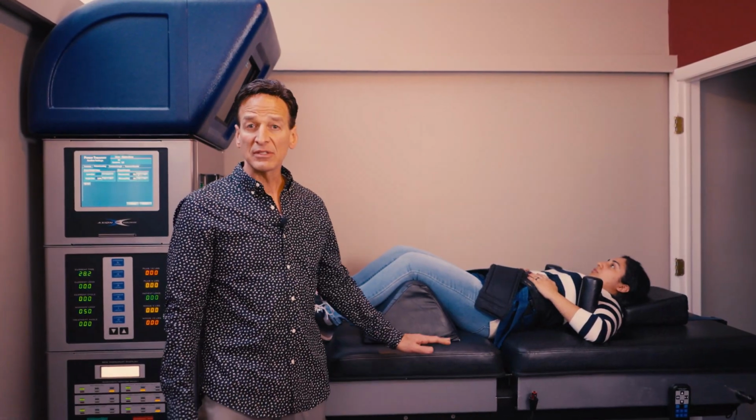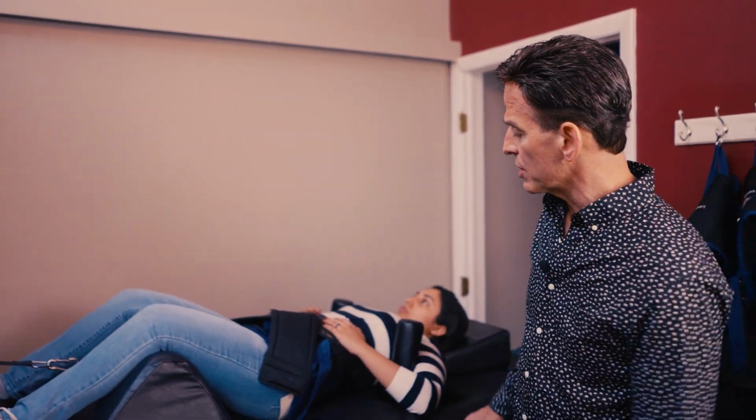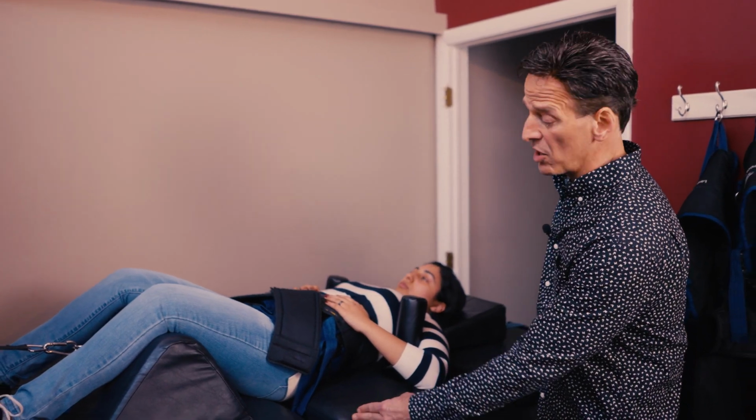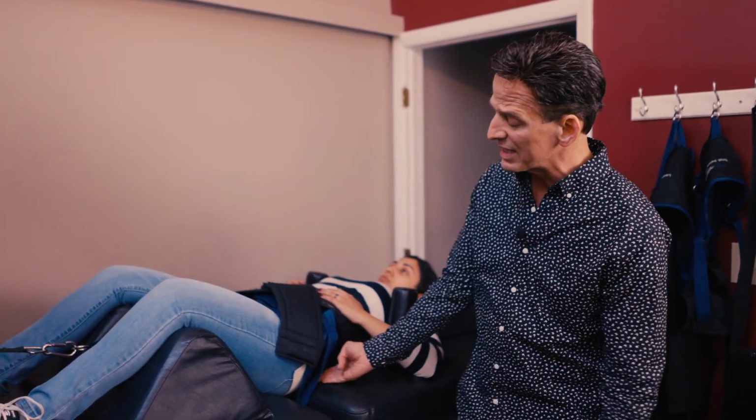So this is the spinal decompression machine for the low back. And you can see the opening in the table here. That's where you're going to be feeling the spinal decompression, the effects of it taking place. Your upper body is stable. It's not going to be moving at all. And the machine is going to be pulling at half your body weight minus 10 pounds. And it's going to be pulling right on the low back, right over the disc area.